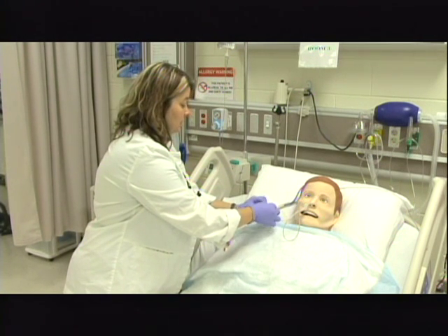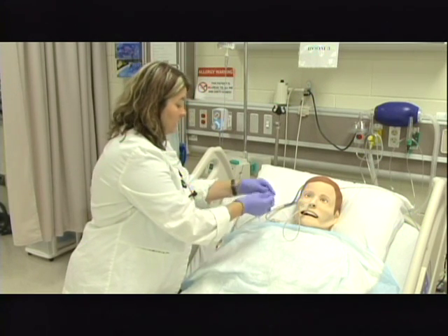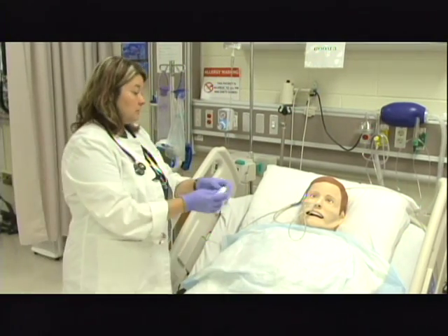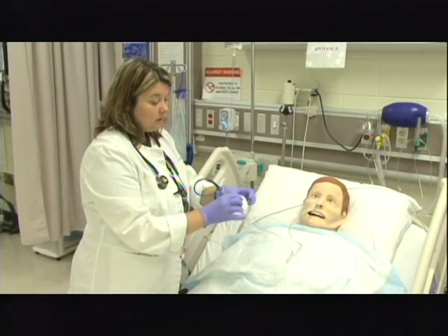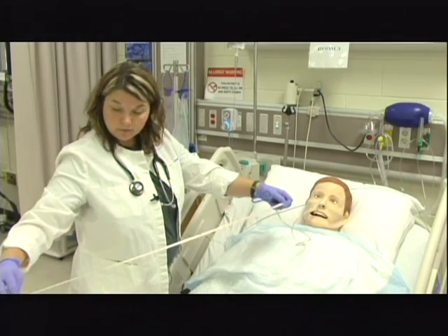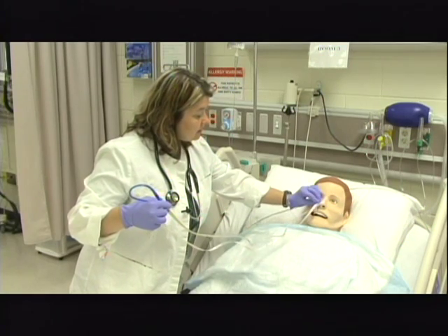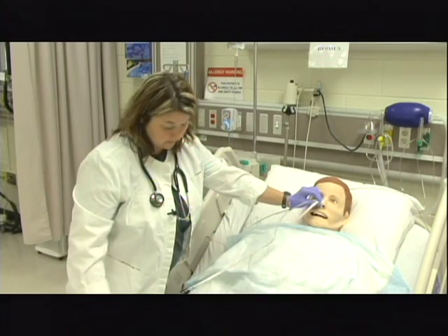So I'm going to unhook this from his gown first, and move the pin and the stuff off to the side if it is in your way. Make sure you save it so you can use it again later. I'm going to stretch the tube out, but without pulling on the patient's nose with the tube. Again, you would have documented the length of the tube from the patient's naris to the end, once you had placed it, or whoever placed it would have done that.